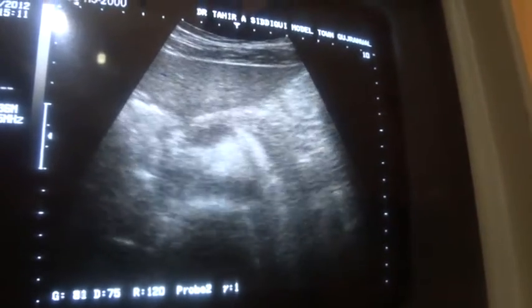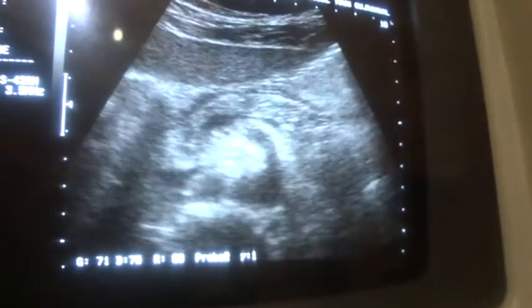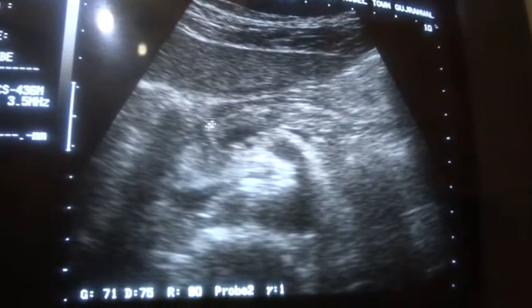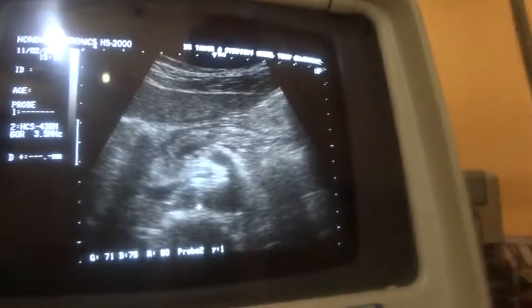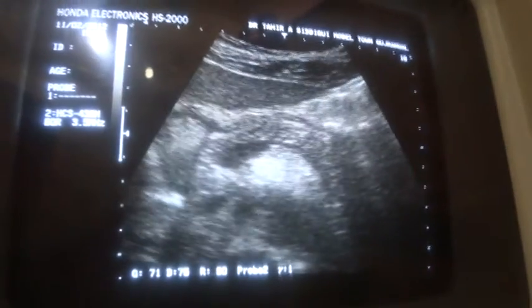Compare the echogenicity of the liver with the pancreas. This is the pancreas, this portion. Compare it with the liver. This portion is the pancreas, this is the splenic vein, superior mesenteric artery, aorta, IVC, superior mesenteric vein, and this is the collapsed bowel. Compare it.